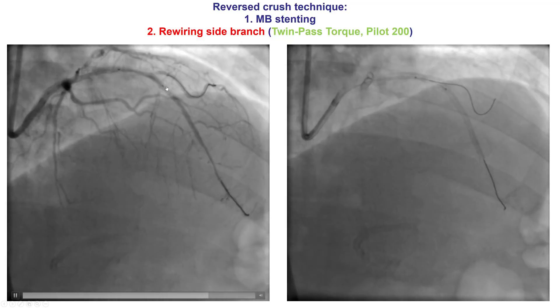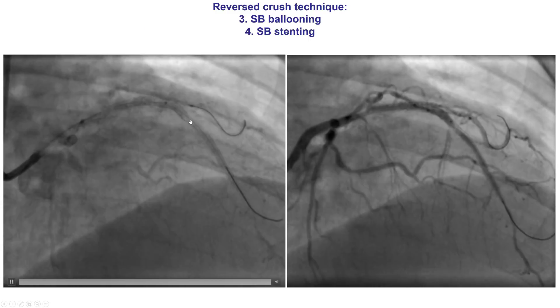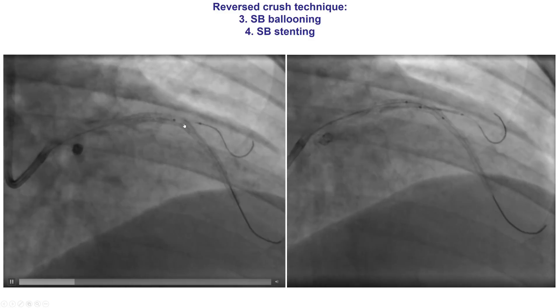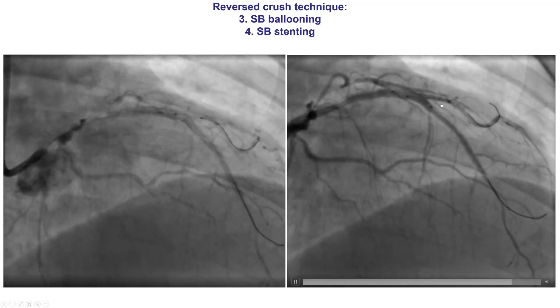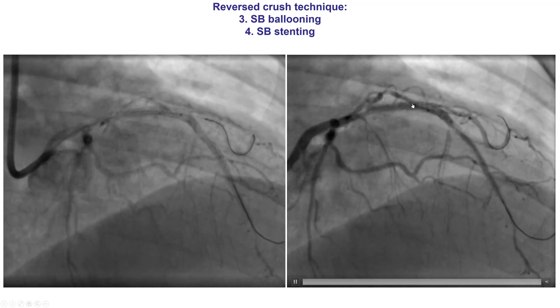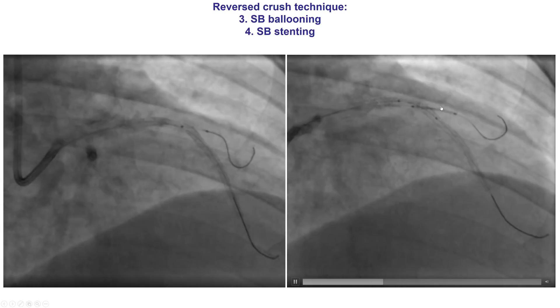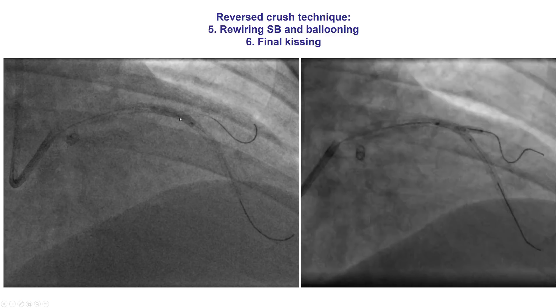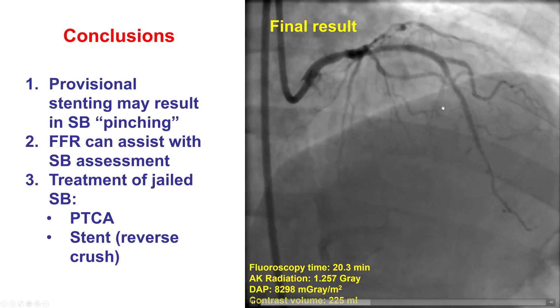We had the stent placed across the ostium of the LAD. We placed a wire into the diagonal branch and ballooned the ostium of the side branch, which still did not look great. We therefore placed an additional stent into the side branch protruding 2-3 mm into the main vessel to ensure the origin of the diagonal was covered. A balloon was also positioned in the main vessel to crush the side branch stent after deployment. We deployed the stent into the diagonal, removed it, and crushed the protruding stent portion by inflating the balloon in the LAD. We then rewired through the LAD struts and performed final kissing balloon inflation, providing a nice result with good flow in both the LAD and the diagonal branch.